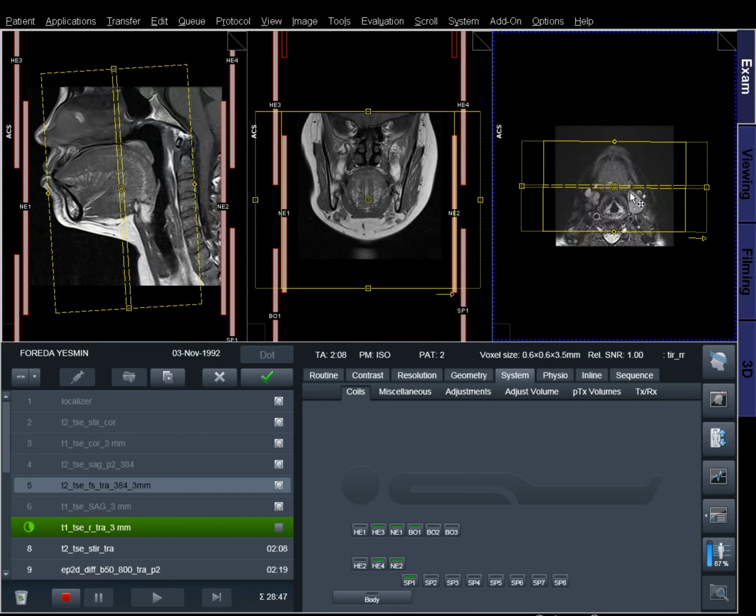So friends, now you know what each face MRI plane means and why it's so important.